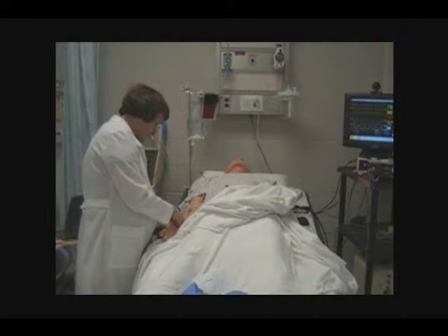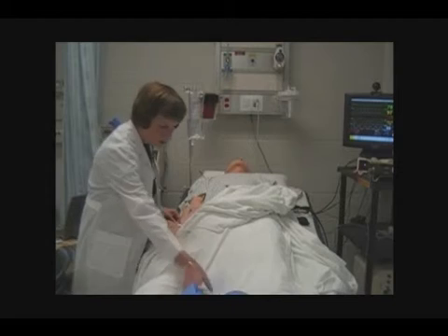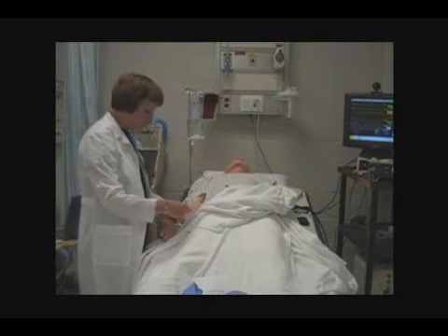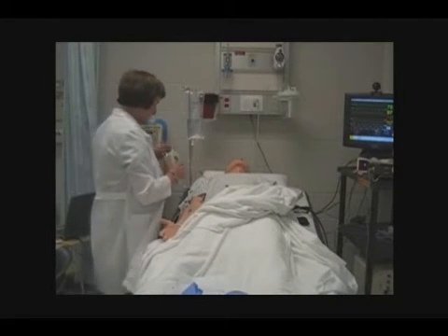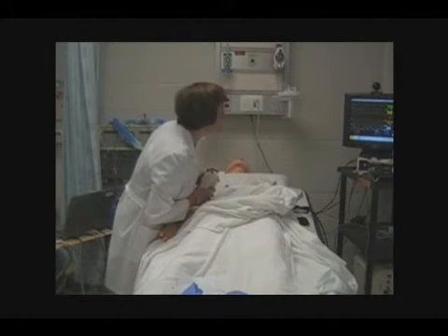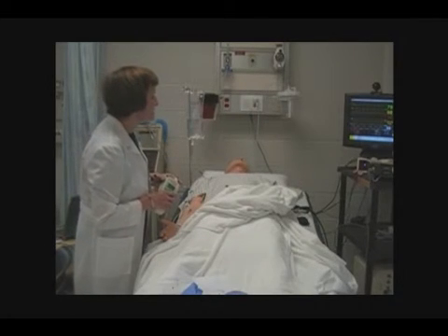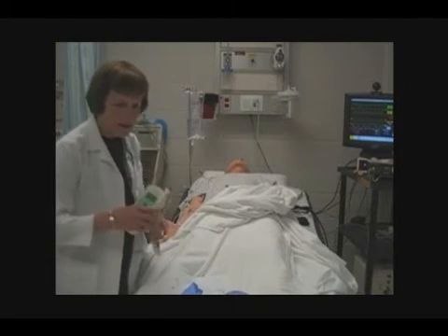I need to check your bracelets, sir. Could you state your name for me again and your birth date, and check your MR number here to make sure that they all match? And indeed they do. I'm going to get your temperature here. Okay, 98.8. Your blood pressure is 127/87. Your oxygen saturation is 98%, and your heart rate is 80. Very good. All right, we have the baseline data completed.